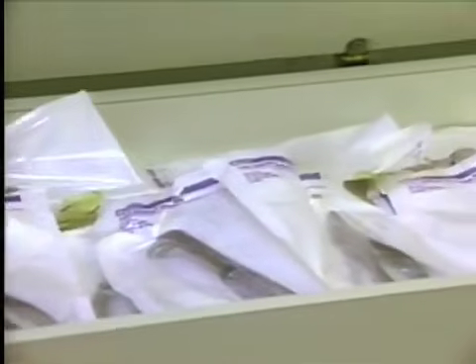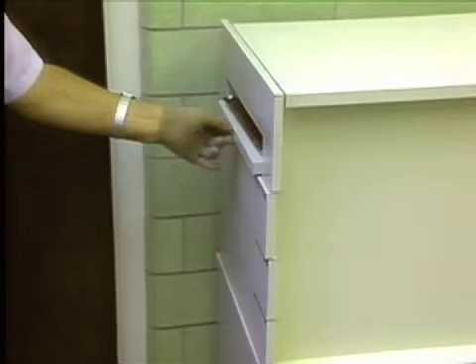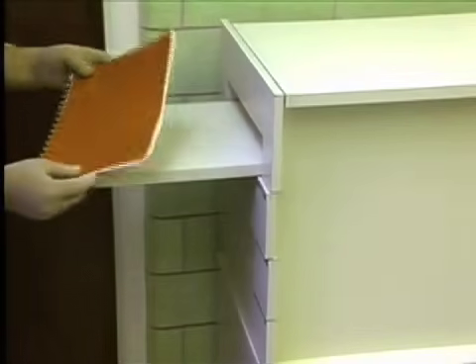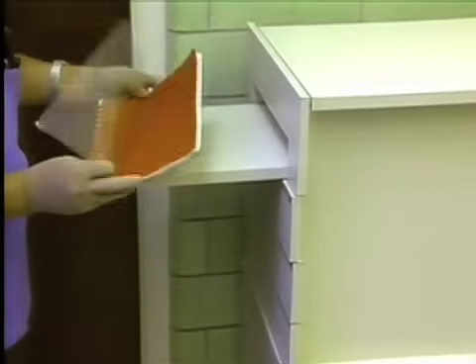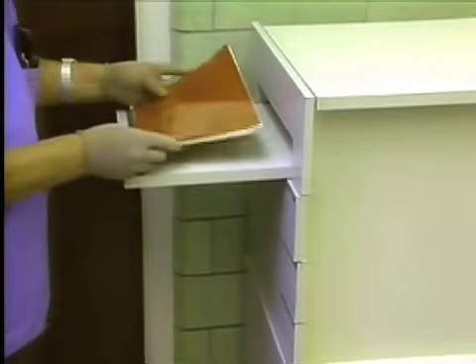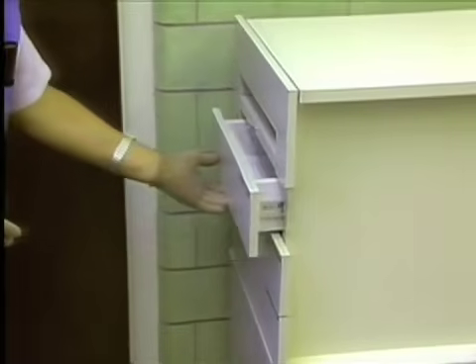They will be removed from this cabinet with a sterile but clean surgical glove. The left bank of drawers will have a writing platform where you will find a surgical manual to assist in the clinic. There will be a blood pressure monitor.